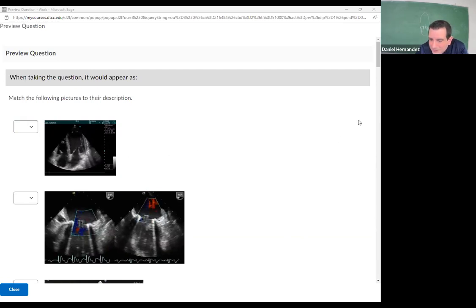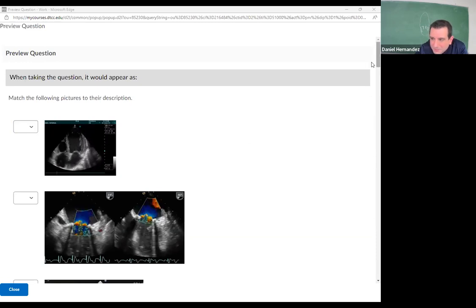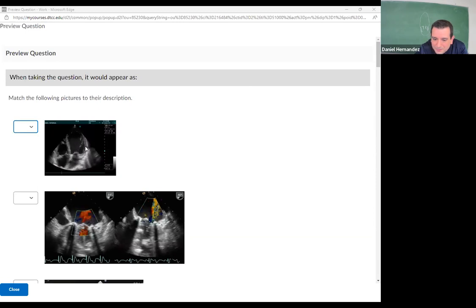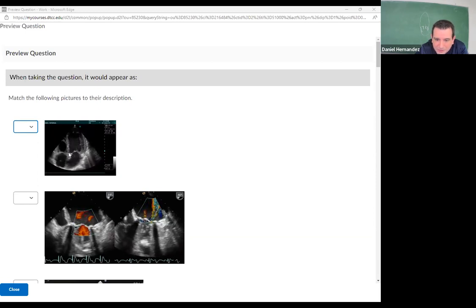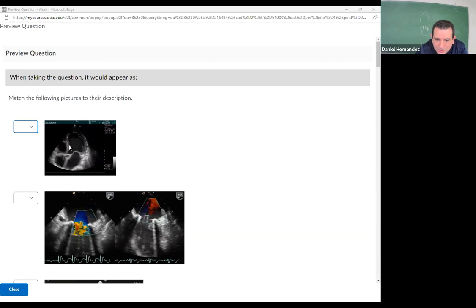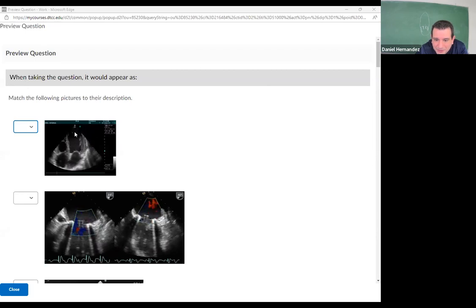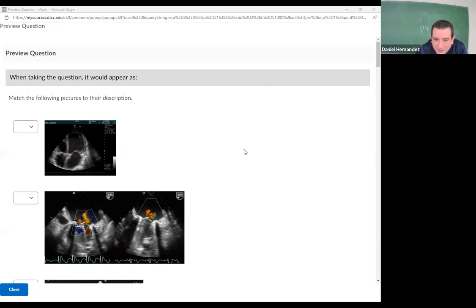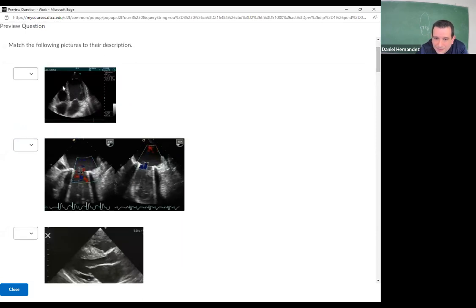So this is kind of like that transition zone. So this probably is going to be right coronary artery. I would say for sure right coronary, because that basal portion is not doing anything. Could it also be LAD? Maybe. Maybe not, just because I see the apex, kind of okay. But anyway, that's going a little further.